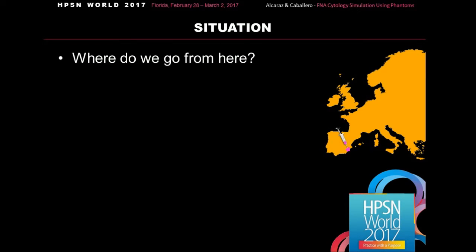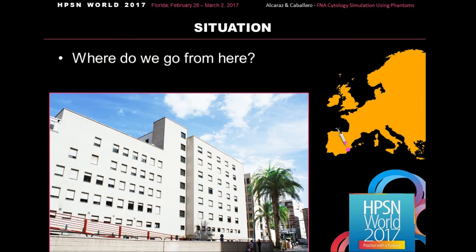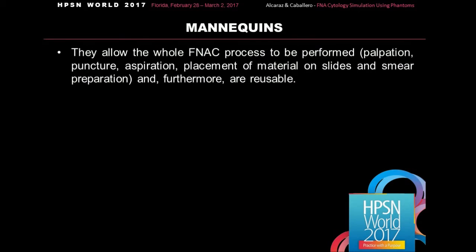We both work in a university hospital in Murcia, in the southeast of Spain. It is a medium-sized hospital with around 500 beds. Then, arising from the need, we developed and patented 2 mannequins with different places to perform fine needle aspiration cytology. And we have applied for the international patent as well. They have several places where you can perform the procedure. The lumps are compressible and you can feel the tumoral lesion by touching them.